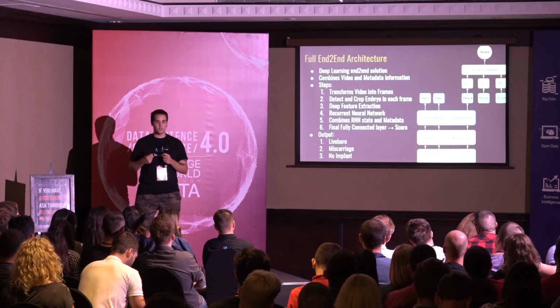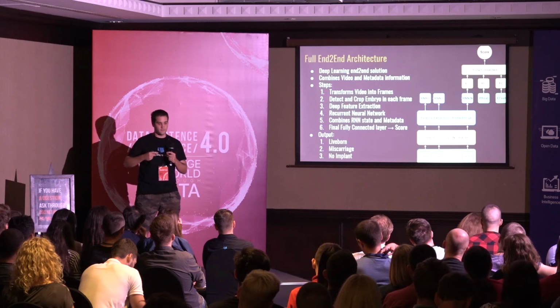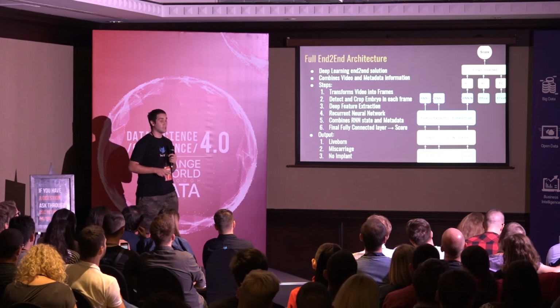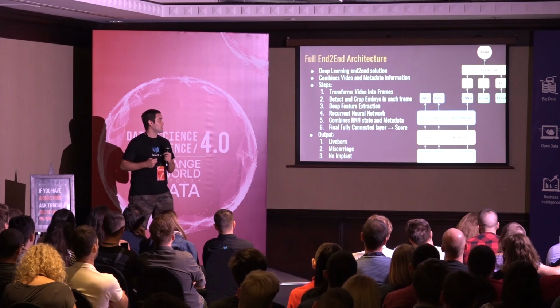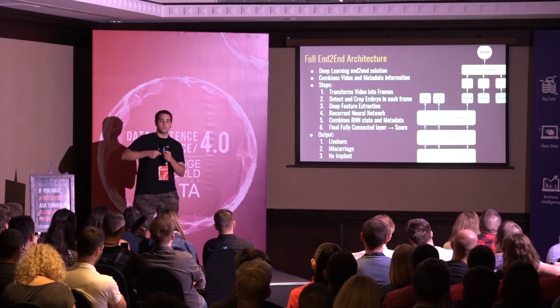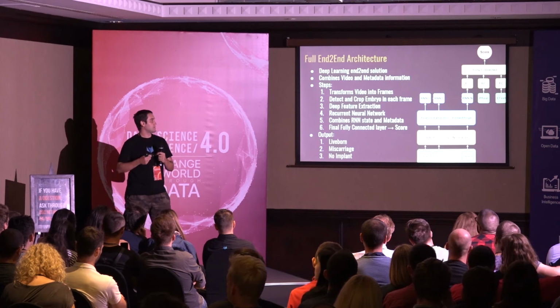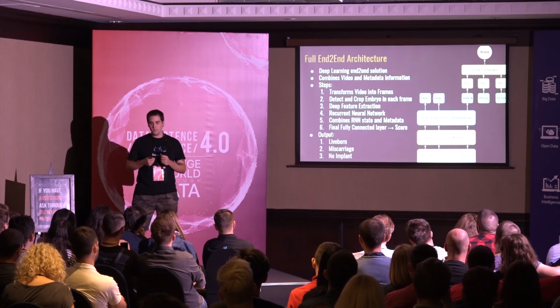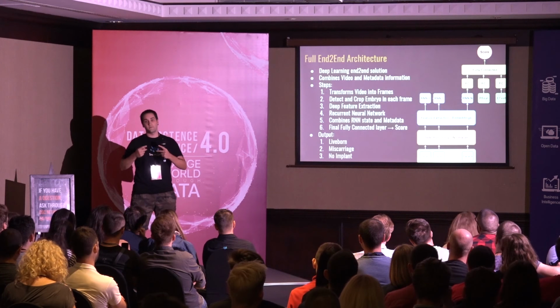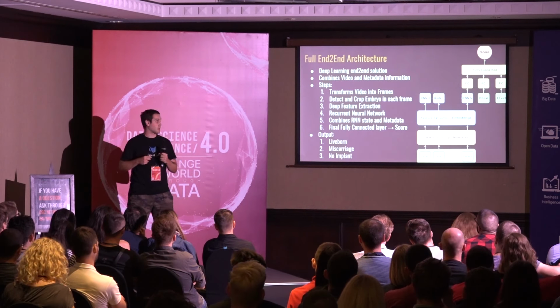After the feature extractor, we get a feature vector, and the thing that takes the whole sequence into account is an RNN, which takes the feature vector on frame 1, the feature vector on frame 2, etc. And then its output can be a probability distribution or another feature vector that takes the whole video into account.